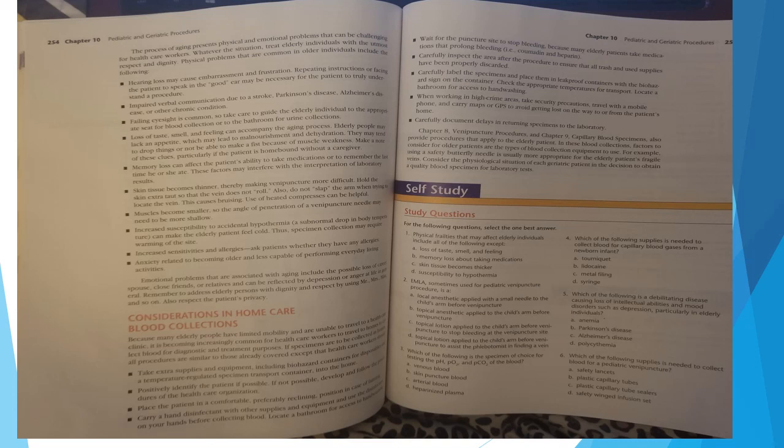In these blood collections, factors to consider for older patients are the types of blood collection equipment to use. For example, using a safety butterfly needle is usually more appropriate for elderly patients' fragile veins. Consider the physiological situation of the geriatric patient in the decision to obtain a quality blood specimen for laboratory tests. This concludes Chapter 10.